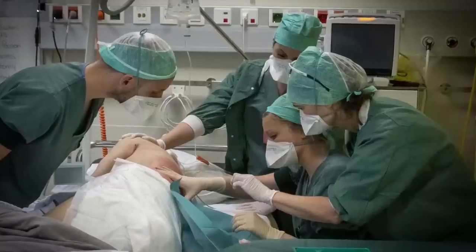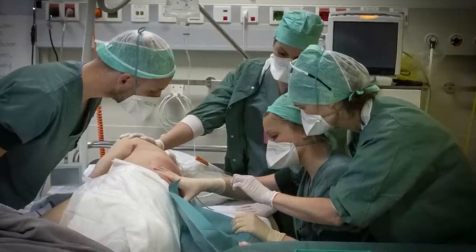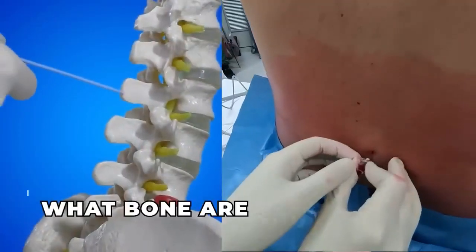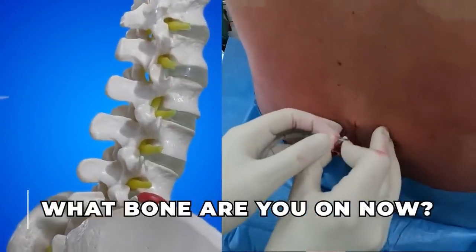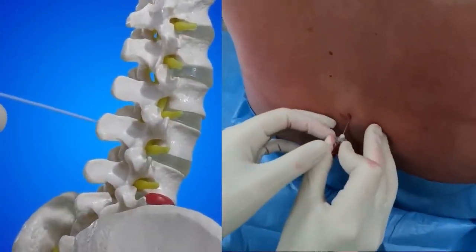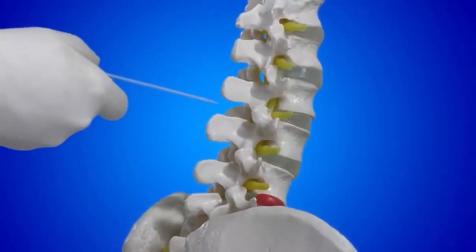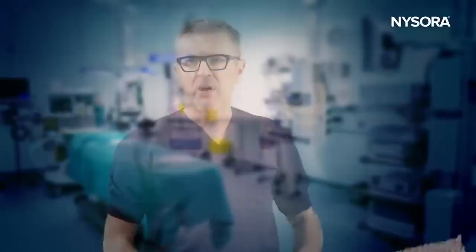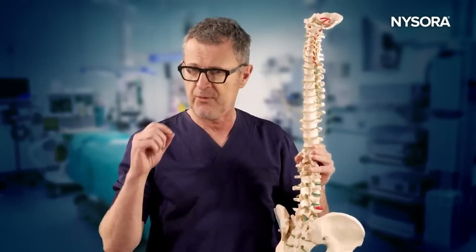As a chief of service, I'm often the one who gets to solve the difficult spinal, and when I step in to help, I usually do not scrub and take over. Instead, I ask the trainee or the colleague I'm helping, what osseous structure, what bone is stopping your needle now? The answer to this question is the key to meaningful redirection and success. And yet, I'm always surprised that no one thinks about this when the needle path is stopped by the bone. I then grab a spine model and I explain the principle of 3 axes, which often solves the problem immediately. So let's get this first, and then we will discuss a typical scenario of a difficult spinal.